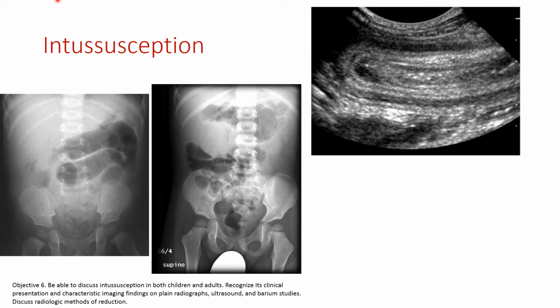We typically use ultrasound for the detection of these. We used to use barium enemas for evaluation of it. We've gotten to where we do ultrasound. It's so much easier, and it's not uncommon to have the emergency room send us down patients to rule out intussusception. We don't want to do barium enema on all those that don't have an intussusception. But basically what we see is bowel, this is colon here, and then we see this small bowel invaginating within the colon.